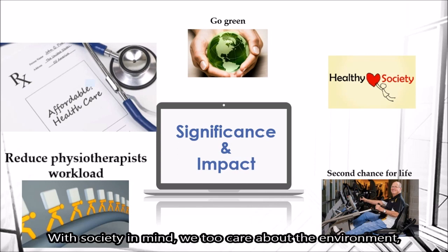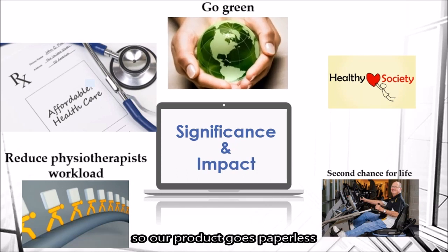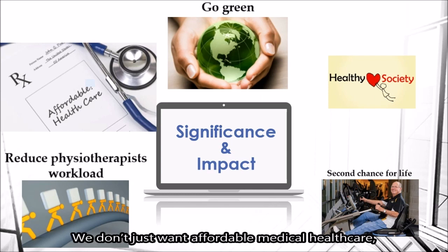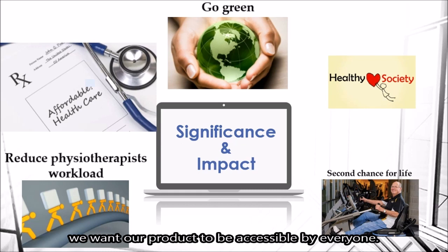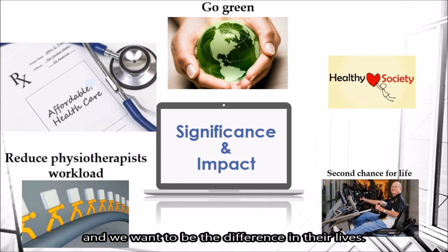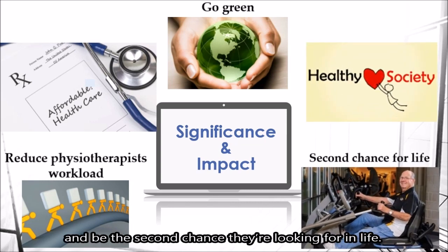With society in mind, we too care about the environment, so our product goes paperless by storing data on cloud databases. We don't just want affordable medical health care, we want our product to be accessible by everyone. 15 million people are affected by stroke worldwide, and we want to be the difference in their lives. Together, we can build a healthier society and be the second chance they're looking for in life.